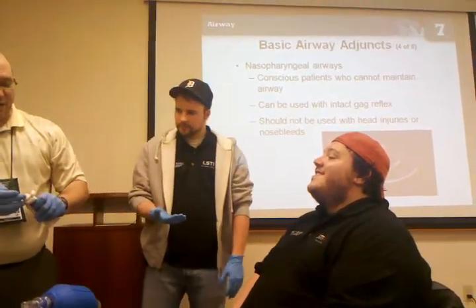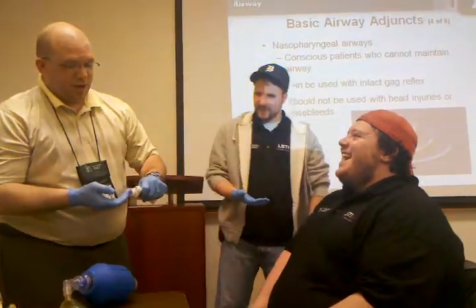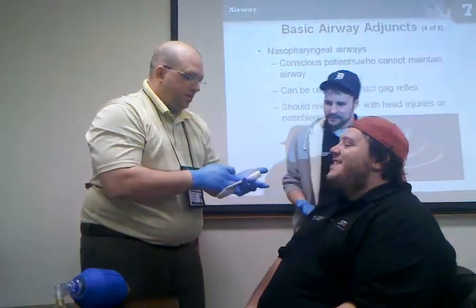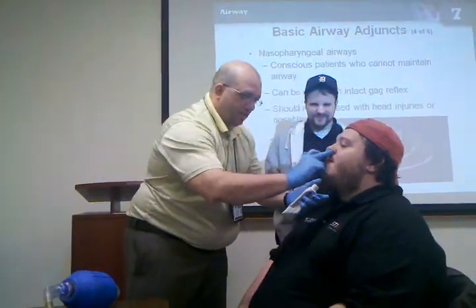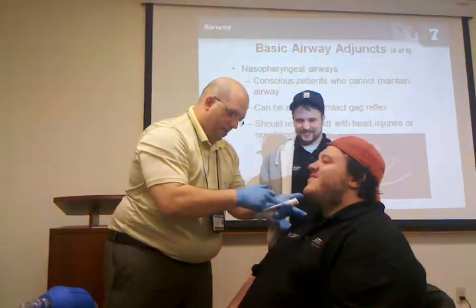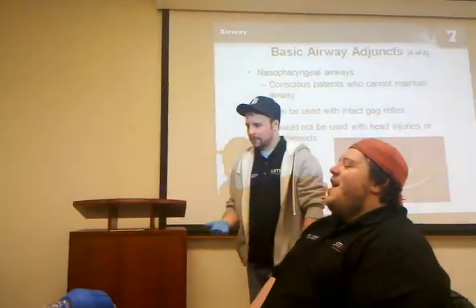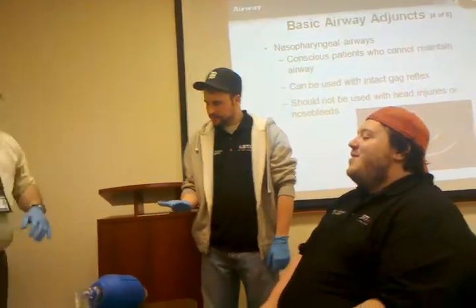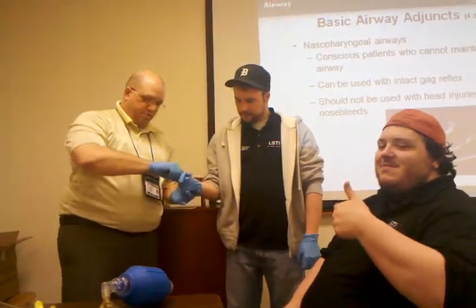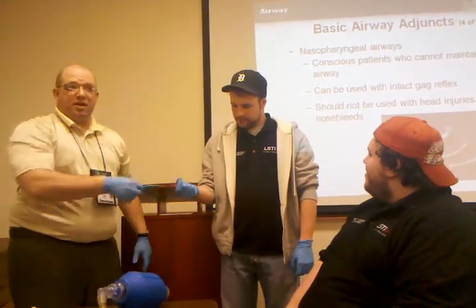So what you're going to do is, we're going to get touchy-feely here. I do not plan on touching you like this today. We're going to take a little bit of this jelly and put it in his nares, just like this. A little bit to the left — I've got something stuck in there. Pick his nose. You can't pick your friend's nose, but this is one of those times. Then you're going to take this, put it in your hand, close your hand, and pull it through. Don't put your hand so tight. So what this is going to do is, he's lubing it up for us.